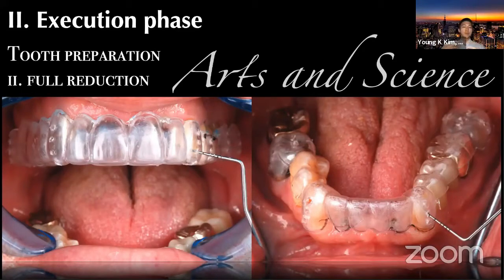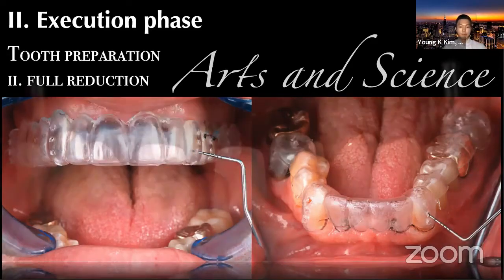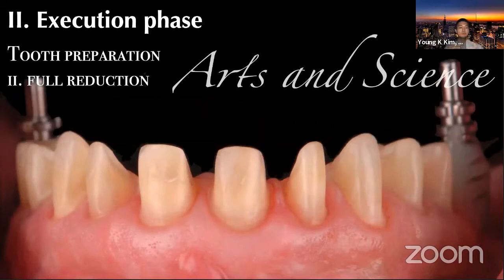Because even if you're using the mock-up as a reference, a baseline, if you don't know how much thickness you've got, there's no way you can predictably visualize where you're going. So, several ways to ensure you're going in the right direction: definitely you need to know the depth and the diameter of your burr. You need to know the diameter of the burr because it's the micro level, and sometimes we underestimate the size of the burr, because once we cut, it's gone. And definitely you do the depth cuts and use a template to evaluate your reduction every time you do the reduction. After you do the systematic reduction, this is the kind of tooth preparation you will get.